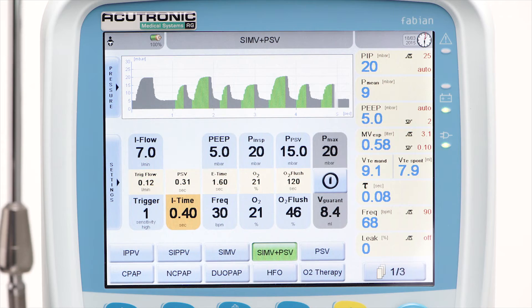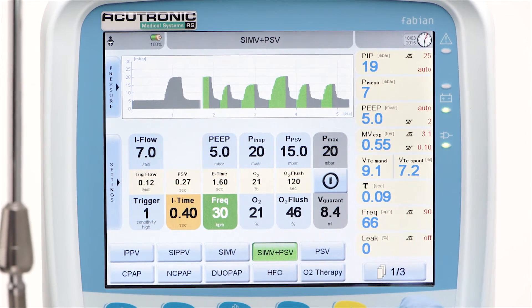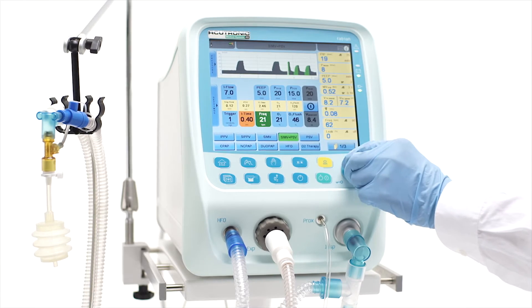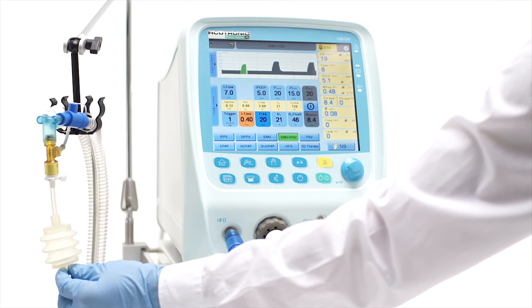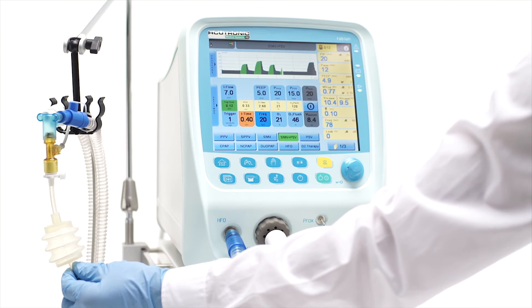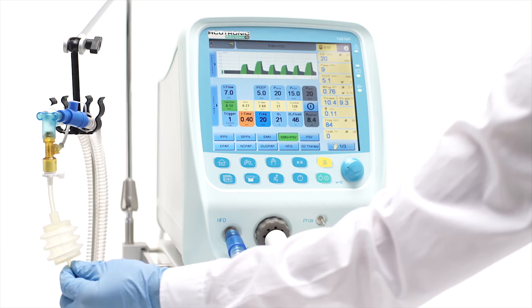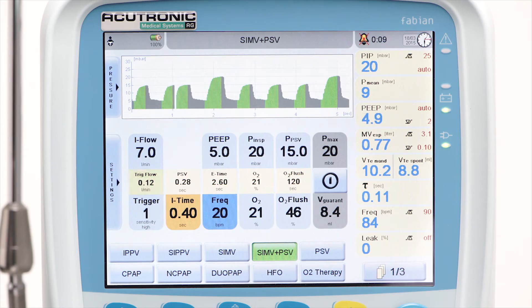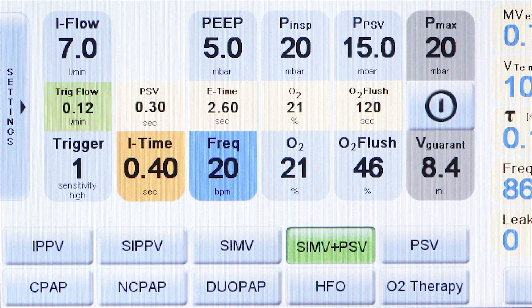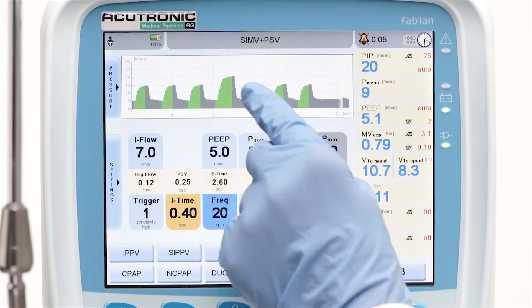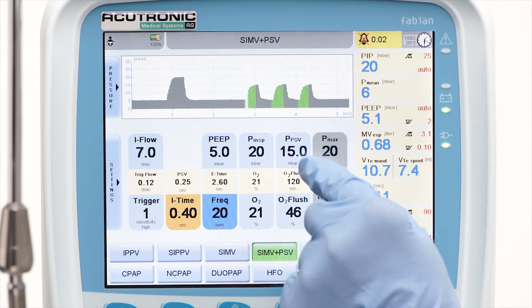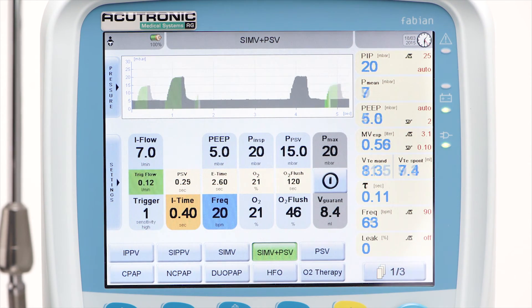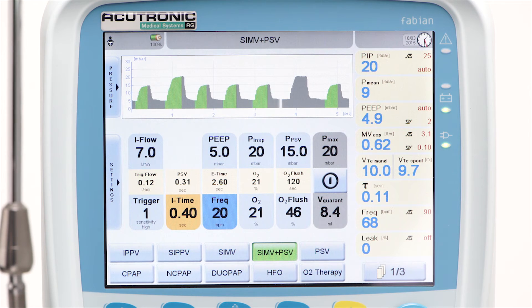In this simulation with lower SIMV frequency, you can clearly differentiate between the two components of ventilatory assistance: the synchronized mandatory strokes and the pressure-supported breaths. The I-time button is orange when SIMV plus PSV mode is selected because of the double function of this parameter — the I-time sets the SIMV breath time.